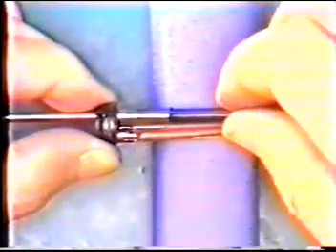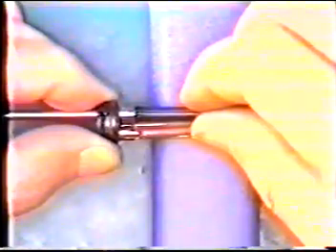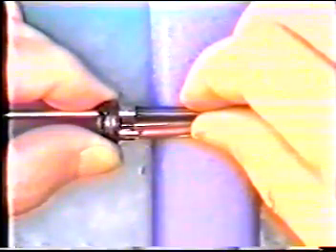Attach FCT. The same procedures as WJT can be applied, except using a guide bar. Final procedure is to attach AWT. Make sure these 3 tubes should be free of any damage and be bonded firmly.